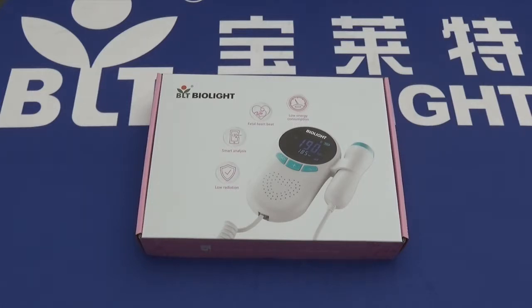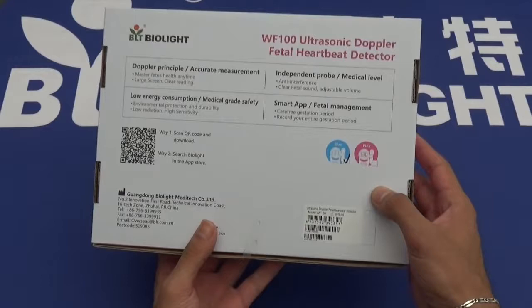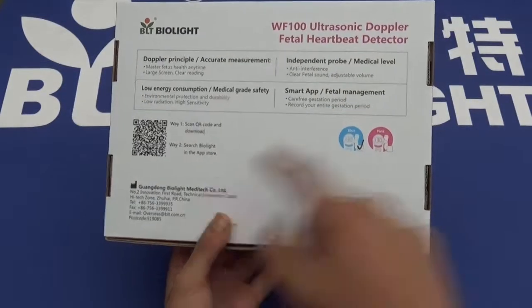A full charge lasts six hours on this device. Taking a walk around the box, we see that it's available in two colors — both blue and pink. We have the blue model here, and the box gives some information about the product and about the company.